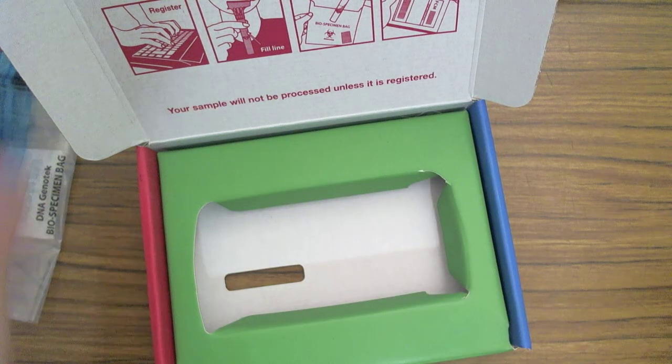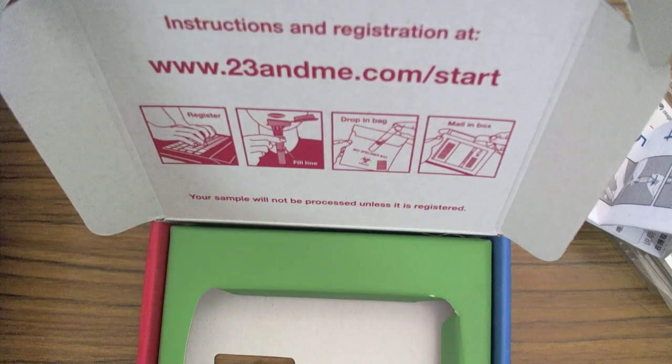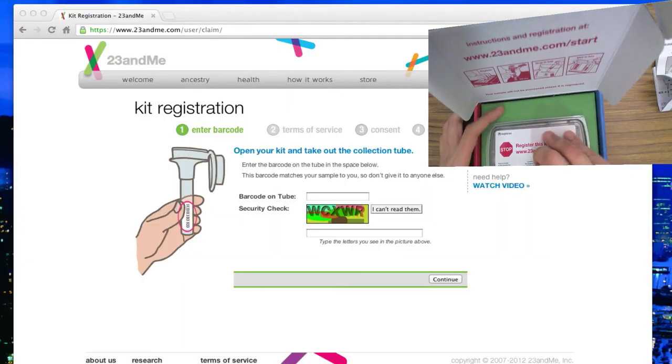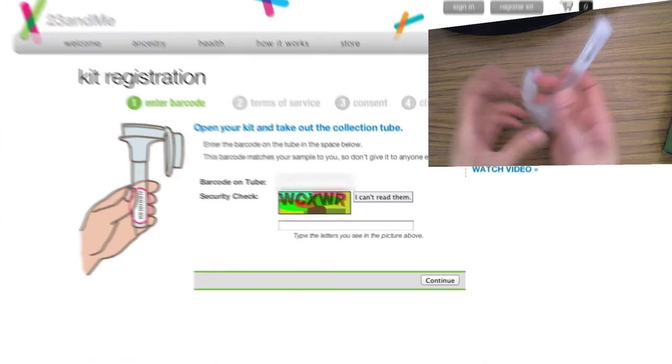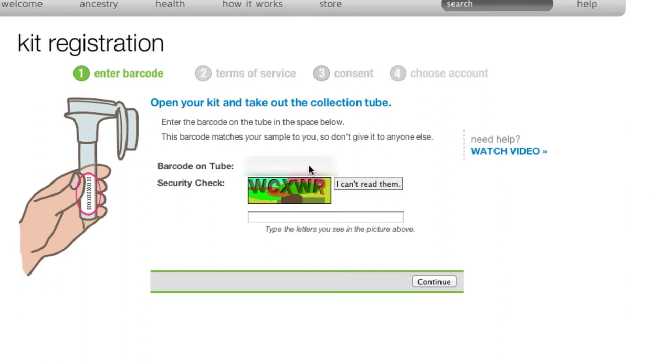So let's head right over to 23andme.com/start and we will register ourselves. What we need to do now is look at the barcode on this spittoon, which I have here. I'll go ahead and enter my barcode — see right there. Go ahead and enter the security check, then continue.